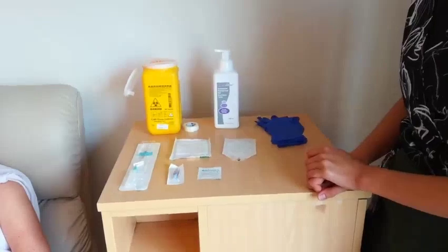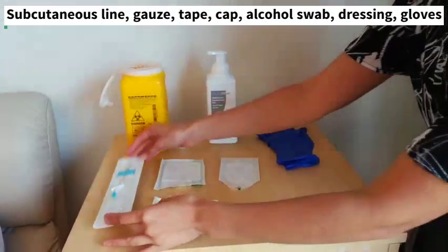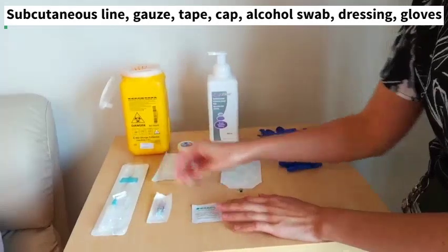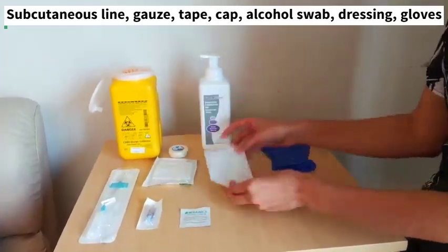First of all, we need to have all the equipment. This is a subcutaneous line. We'll need some gauze and some tape in case we have to remove and start again. There's a cap, an alcohol wipe, a dressing, and some gloves.